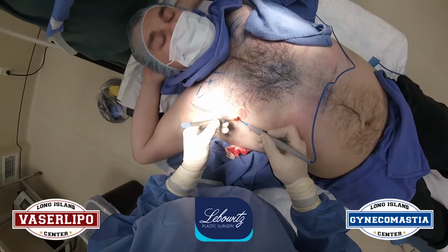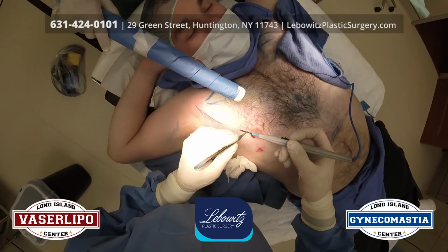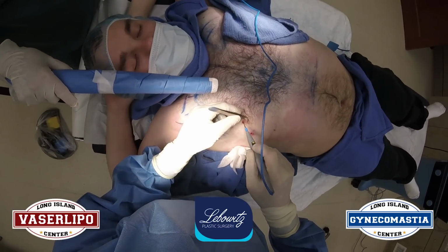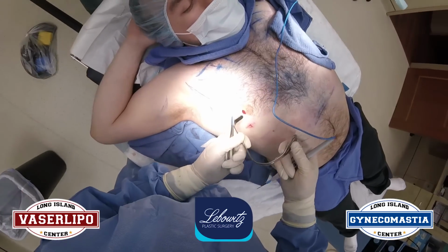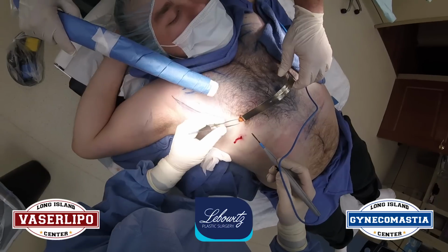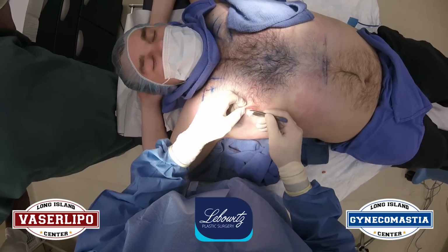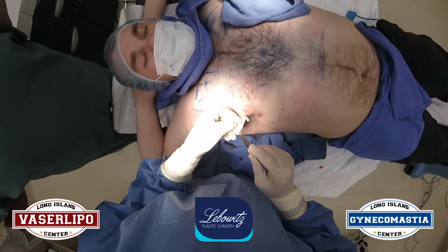And I'm just cauterizing some fat, and this is actually insulated there, so the top that works is just there. So next we have a little teeny retractor. Get right in there so I can see. Make sure again there's no fat lurking. So make sure there's nothing going on, because a lot of my patients come from out of state, so I don't want them to have any problems, and just very cautious about everything.